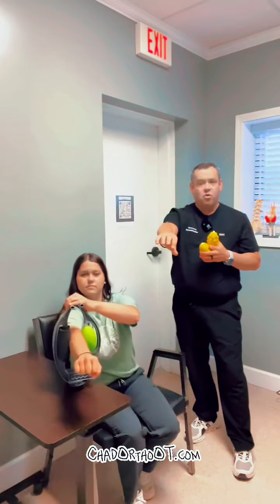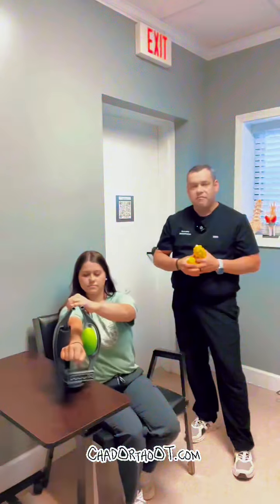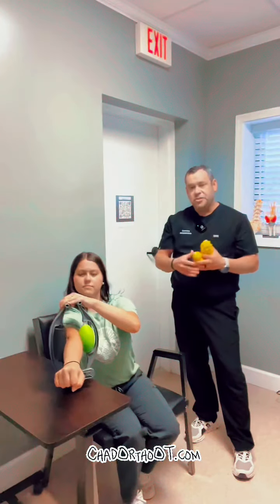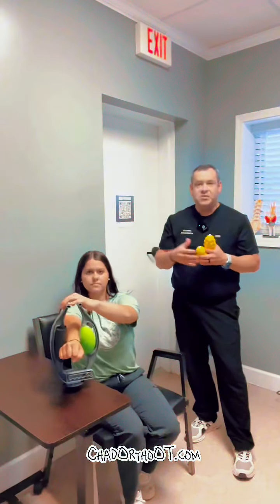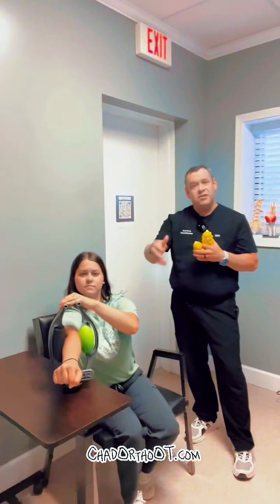You can adjust the bottom of this to the size of your arm. She's going to squeeze this together at the top and then just roll her arm back and forth through there, or press her arm back and forth. What she's getting is just a myofascial release — soft tissue mobilization there.